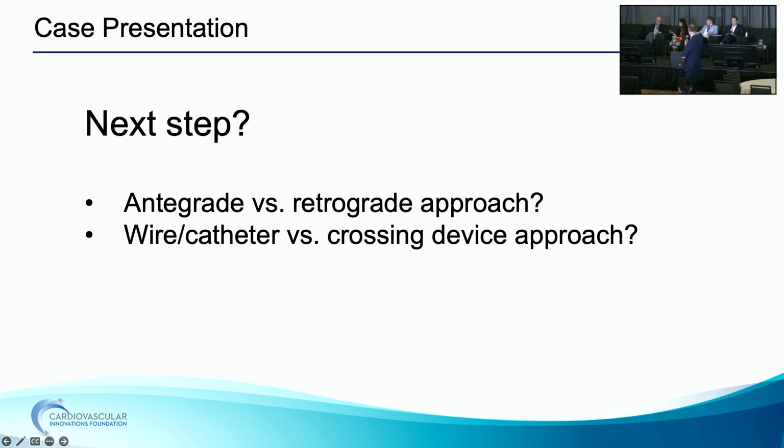Yeah, agree. Antegrade and wire catheter. All right. Yeah, in short CTOs, I do a lot of live cases, I never will do a short CTO as a live case. They tend to be more difficult than long ones when you've got a bunch of branches. So I'd get a bunch of obliques, and then, like you said, prep the foot so your staff knows. We maybe do one retrograde from the beginning.